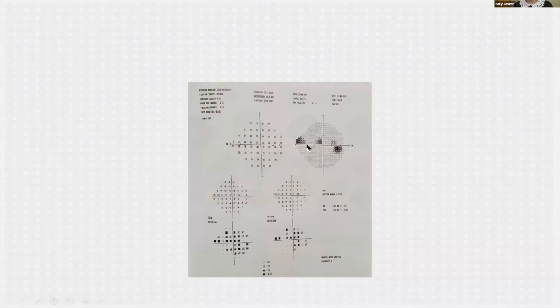And the final thing that I wanted to show is to remind people, it's not just the size of the visual field defect that's important, but it's also the location. So this is a fairly young patient who unfortunately ended up having a paracentral, very close visual field defect, and the vision suddenly dropped from 6/5 to 6/24, 6/36, because they were very unlucky and unfortunate as they lost the visual field right in the center.